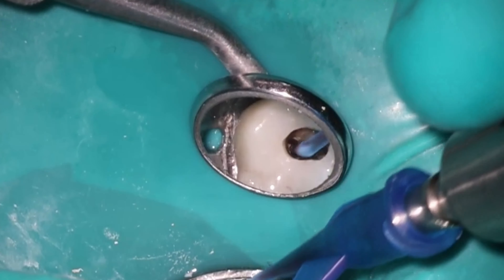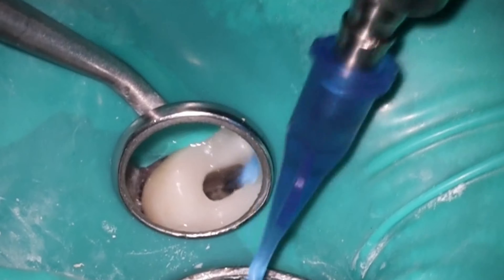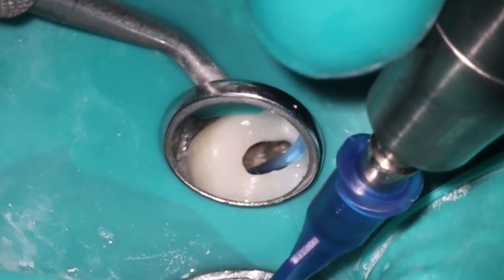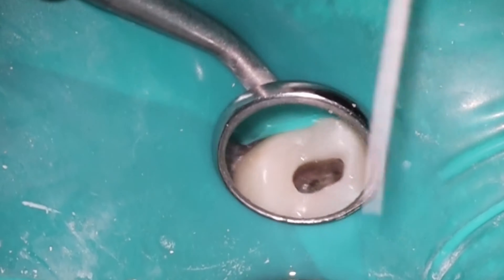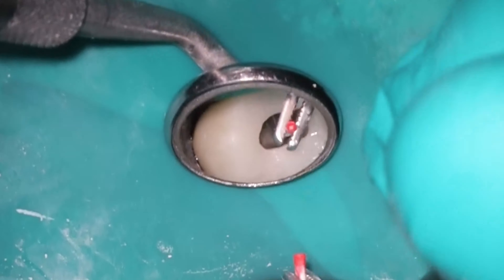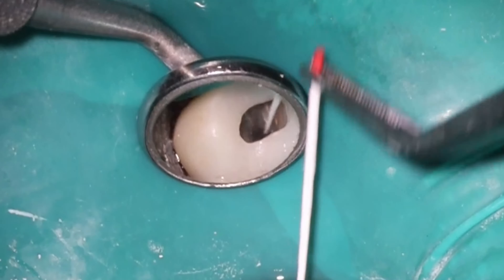We are all done here. Using the file forceps to remove the platform — and you'll see not a lot of bleeding. That's one of the beautiful things with the clean flow: you don't tend to get a lot of bleeding with it. Not sure if you saw that, but when I suctioned out of the MB2, it actually suctioned out the MB1 — so the GentleWave was able to create a path in there that my files couldn't. That's about as much bleeding as I get. With these paper points, that's a totally normal amount, very easy to get these cleaned out.